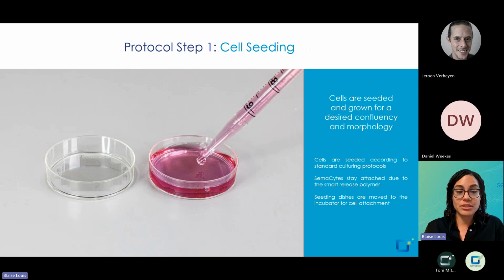So the protocol for using SemaCytes is quite simple and begins as many standard tissue culture protocols do. The cells are seeded at the required density and in the required medium, and they attach to the SemaCytes, which remain immobilized due to that smart release polymer, which slowly releases over time. During seeding, the seeding dish can be kept on the SemaPlate to ensure that they will remain at the bottom of the dish during cell attachment. And then following seeding, you just move the dish into the incubator.